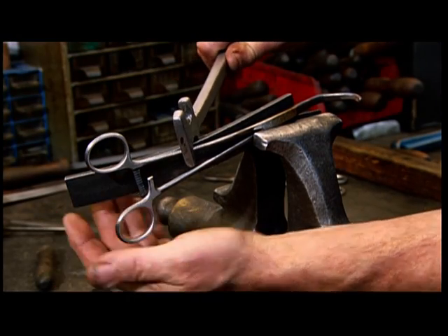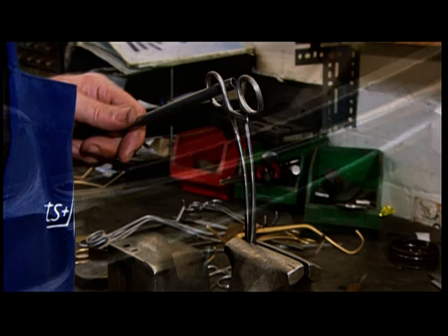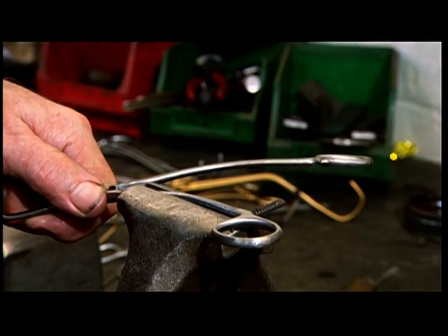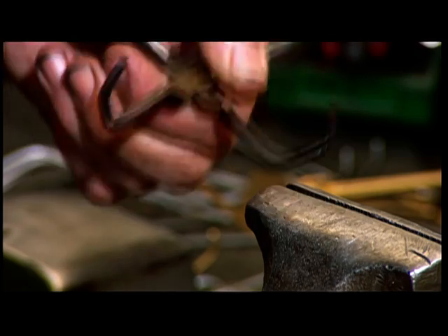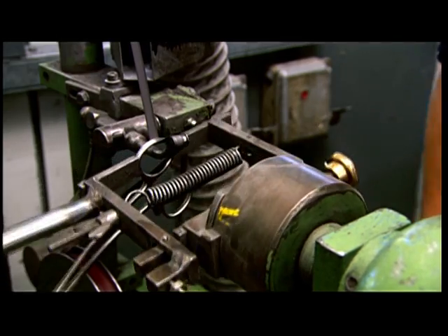Next, using a variety of tools, he adjusts the shanks and the finger bows to give them a more ergonomic feel. This is called soft setting because at this point, the metal is still soft enough to be manipulated. He tweaks the bend of the jaws until he's satisfied with the curvature. He smooths the inside of the finger bows with a fine abrasive belt.